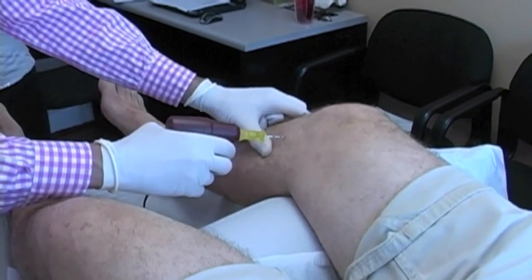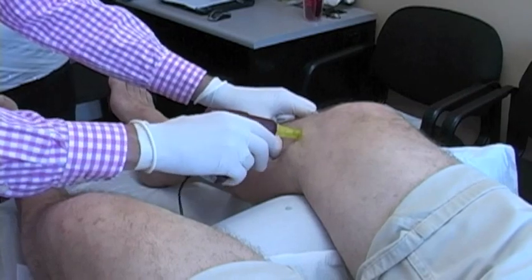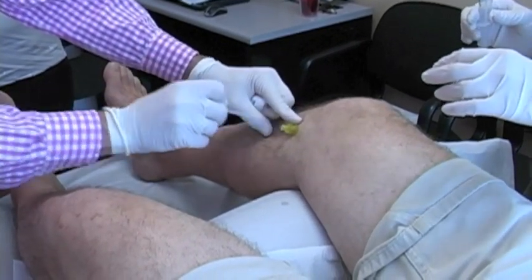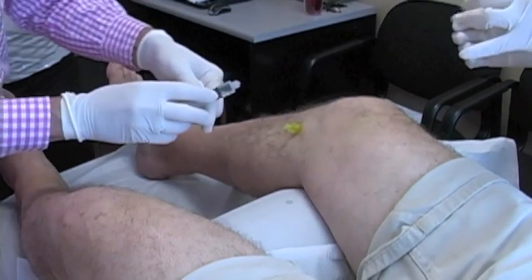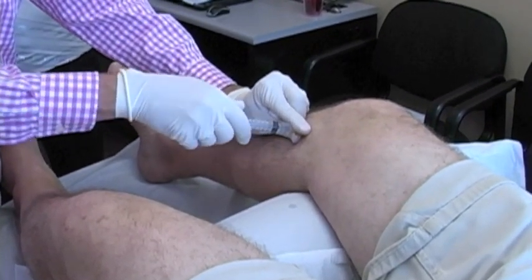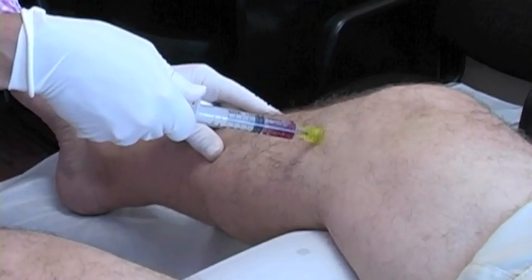Here I'm using the easy IO drill and I'm drilling into the bone marrow into the person's right tibia. You can see I take out the stylet and then aspirate out the bone marrow. You'll see the bone marrow comes out — it's coming out fine here.